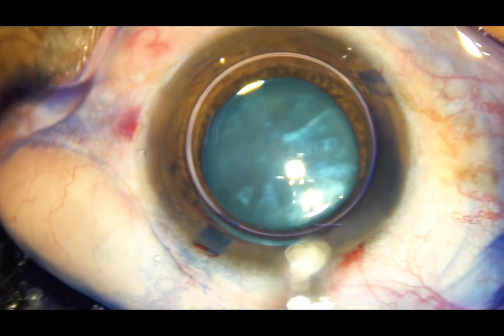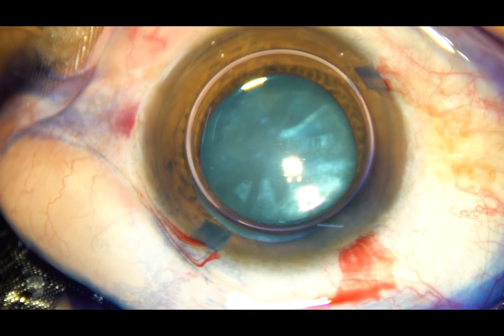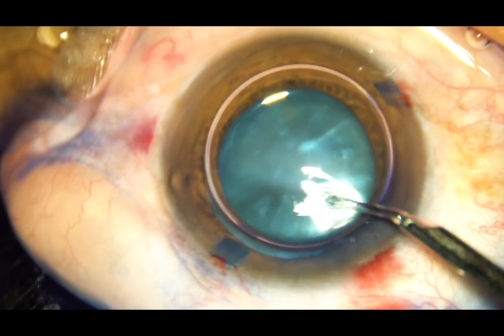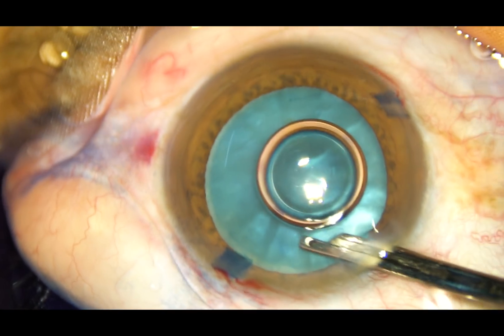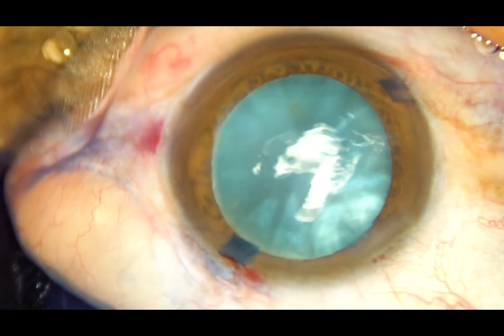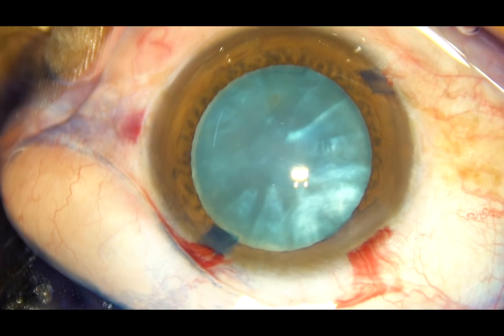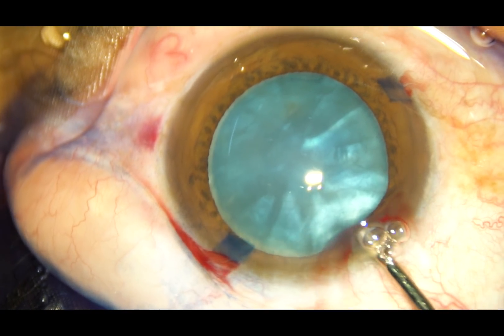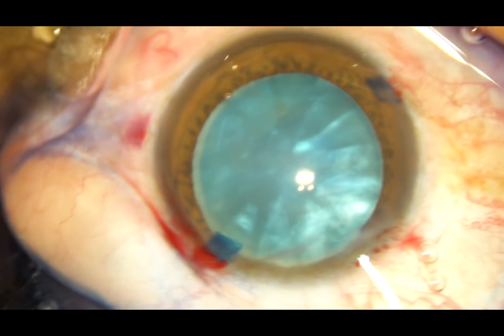This is a bit of adrenaline. You can see that the pupil has dilated, but not fully. So adrenaline may help in keeping the pupil dilated. And adrenaline has caused — you can see the white ring around — it means that adrenaline has caused some more amount of dilatation.